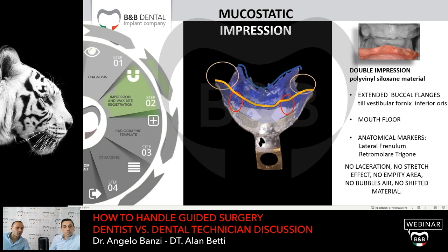It's not like the palate area. This is going to complicate the whole case, all the structure. So that's why most of the authors in the literature say that the big inaccuracy is in the mandible, because I've got a very high resorption of the alveolar bone, and working over the basal bone is going to be really tough.